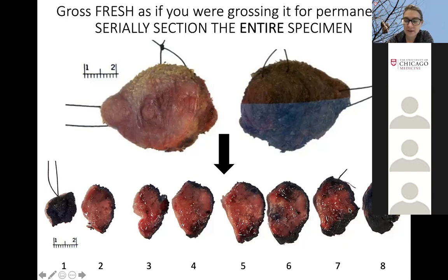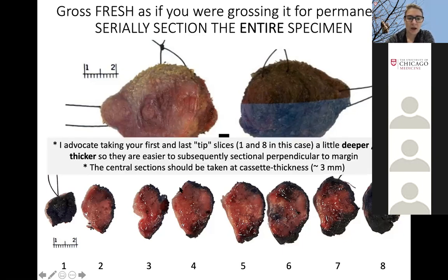And the remainder of your slices are seen here. It is only in this manner that you can actually evaluate the cross sections of each slice and determine what to freeze. Are they still asking us to do the liquid nitrogen?